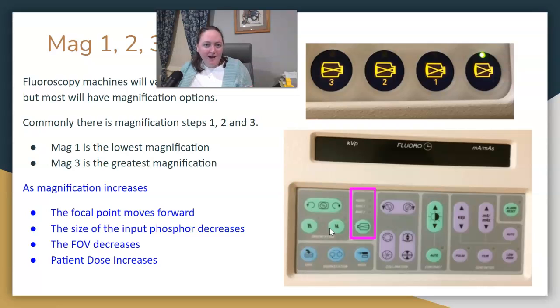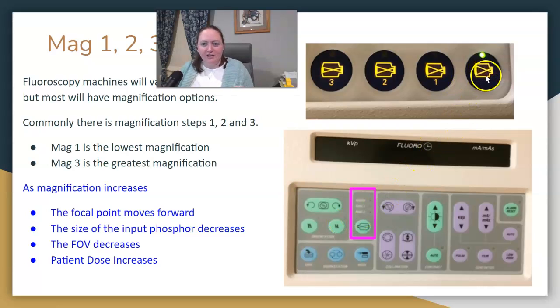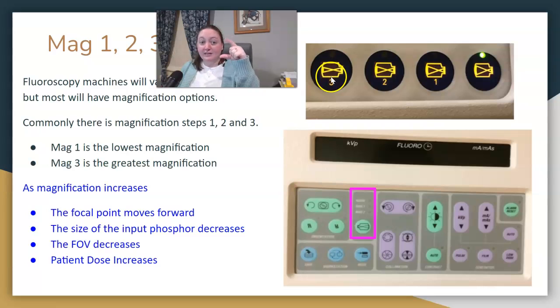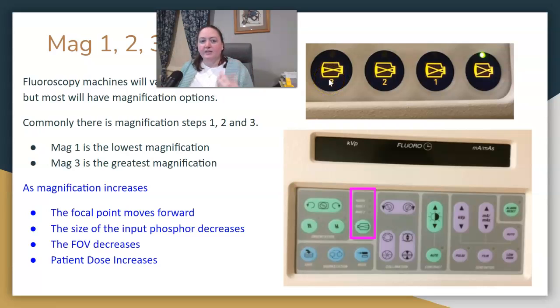Each time you mag up, the focal point moves forward. You can see the focal point moving closer each time and the field of view getting smaller each time.